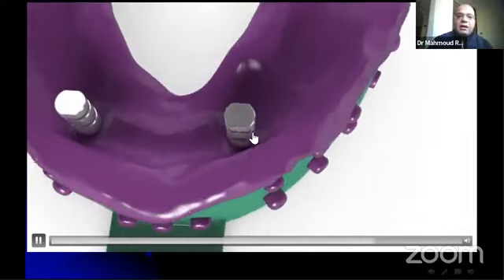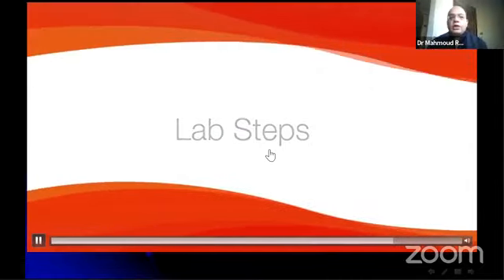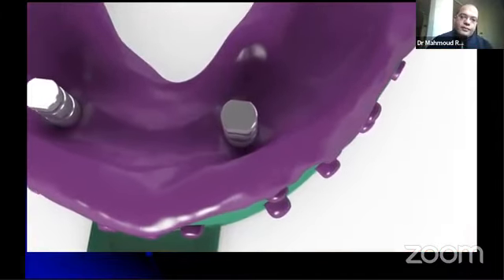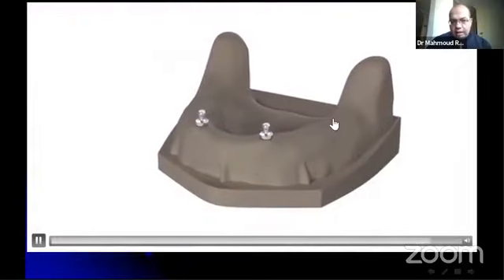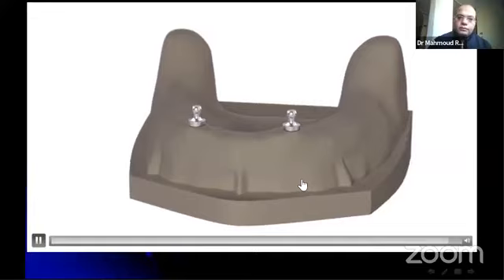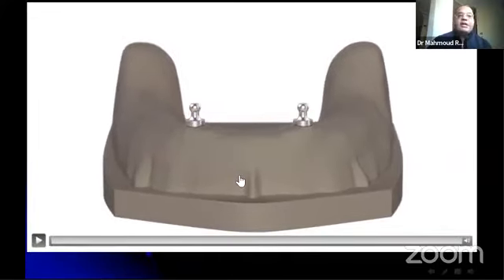Verify that the ball abutment and implant analogs are properly seated in the impression. Send the impression to the lab in order to make your prosthesis. Then the lab adds a soft tissue replica. Fabricate a working model using high hardness stone. Articulate the model according to normal laboratory procedure. Here the lab has a positive replica of your patient's mouth that can make the denture over it.